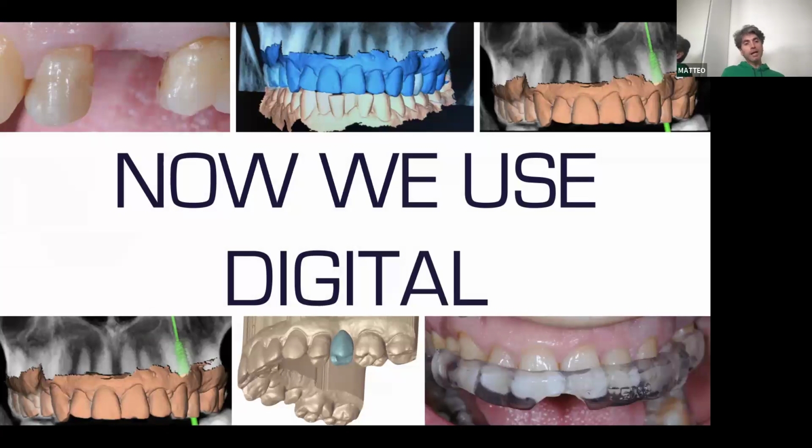So, but now we're using different protocols, digital protocols.